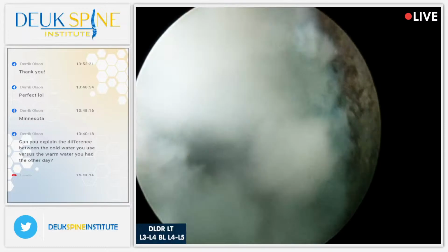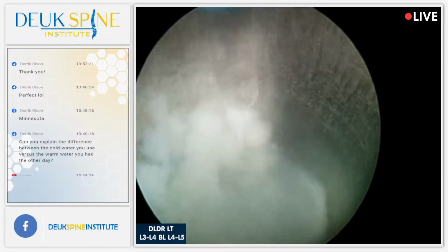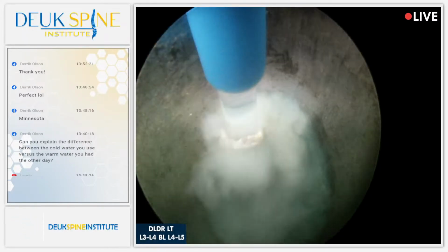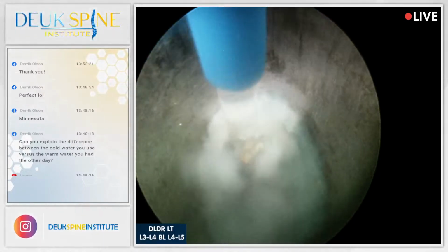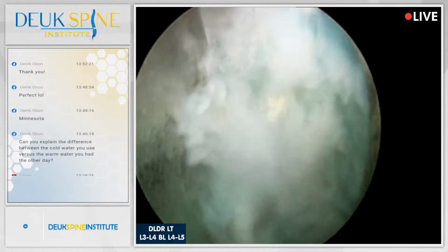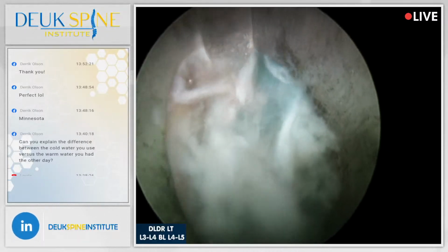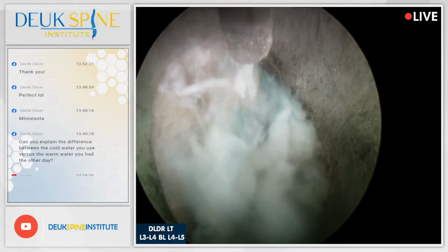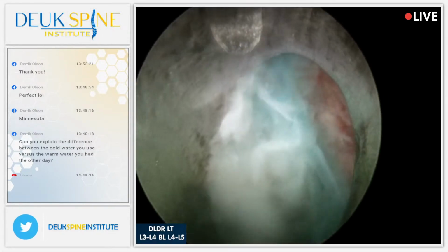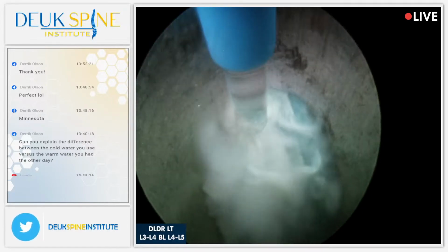All right. Well, for those of you who have watched a few of these surgeries, you see they're pretty much done the same. The real magic sauce is picking the right disc to fix. That's what I call the diagnostic part. And once you've done that, the rest is just a technical job, getting it right technically. By the way, look, left is the top of the L5 vertebral body. That's the bone there. And right is the bottom of the L4 vertebral body. And in between is the disc. A lot of compression right here.